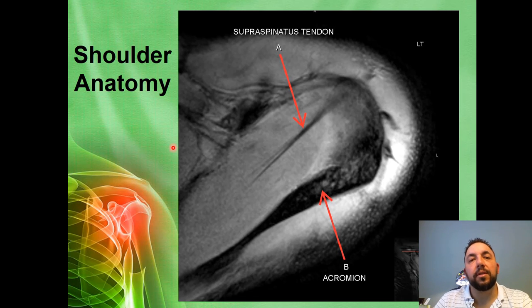We're going to focus on the specifics that are important when establishing or acquiring our images. We're going to have a bit of a recurring theme in this particular discussion where we talk about angulations and what are the appropriate scan planes that we utilize in MR imaging in almost every single orthopedic application.